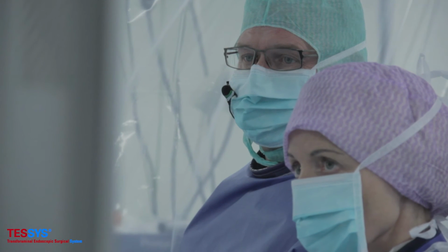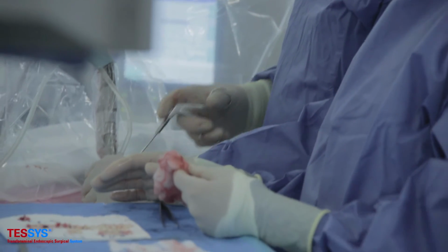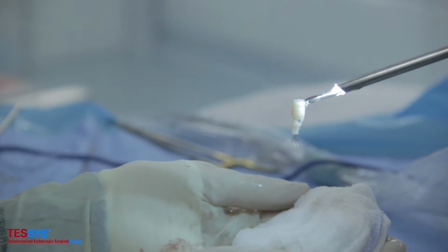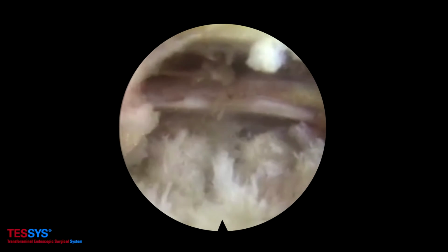The disc herniation is removed now. In most cases, however, we have to remove the degenerated disc protrusion in small pieces. The decompressed dural sac is moving synchronically with a heartbeat.